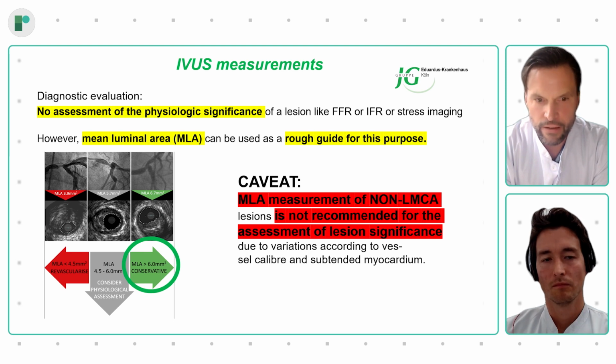Secondly, I would say the proximal lesion alone, even if you perform FFR measurements, you can sometimes be fooled, because only with intravascular imaging do you really estimate the absolute amount of restenosis, which was huge in this patient.